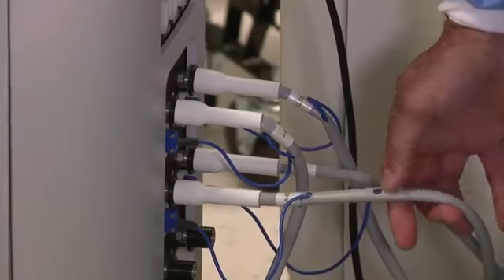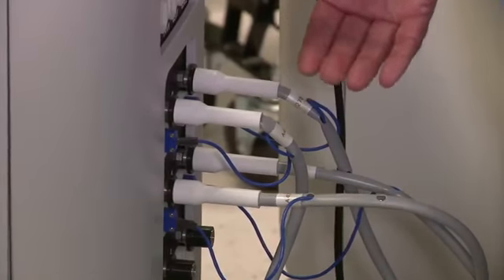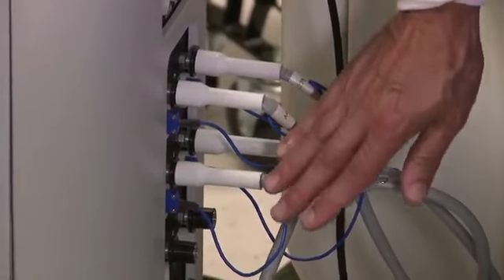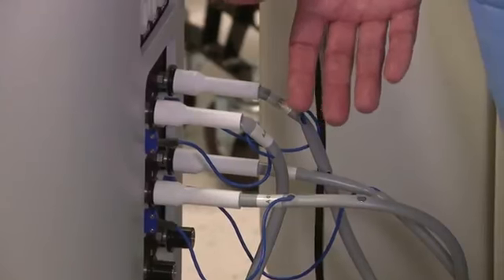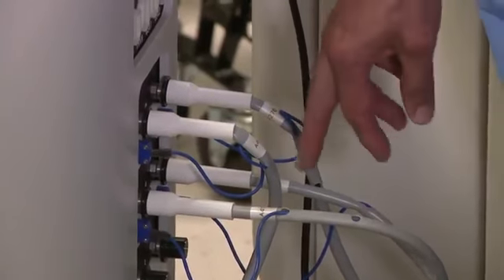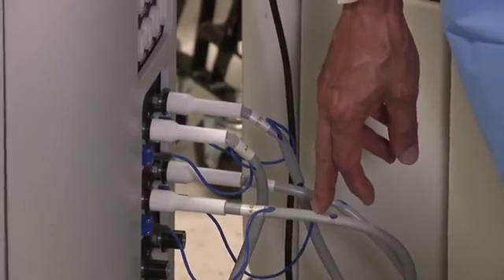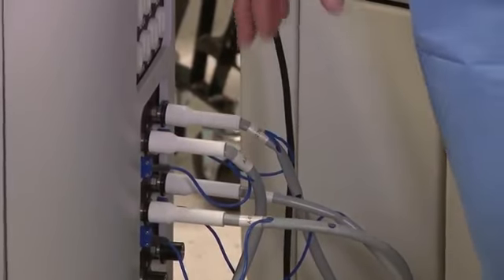This, I want to point out, is our vent holes. When the machine is running, you'll hear gas coming out. If you put your hand here, you'll feel gas coming out. That's normal. Argon and helium, of course, are both inert and not harmful. But that's a normal thing. When you first start doing these, you might think you've got an air leak under here, and that's actually what you're looking for.